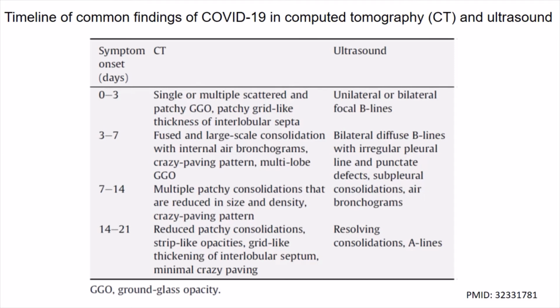Although lung ultrasound has several advantages, including the absence of radiation, lower contamination risk, lower cost, and repeatability, one of its limitations is the relatively lower sensitivity in comparison to chest CT scan. Another disadvantage of this imaging modality is that ultrasound cannot usually detect lesions that are deep and intrapulmonary.